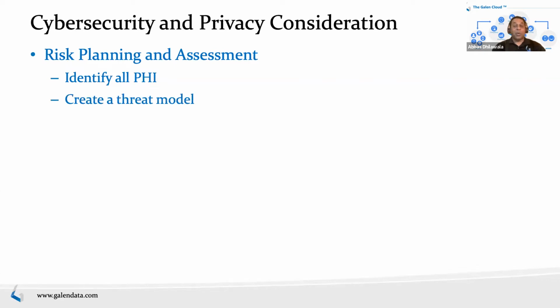Do threat modeling. What threat modeling does is essentially identify risk not only from a device perspective, but from the environment itself. So it's not what can go bad in the device, but what can go bad in the device if it is connected to, let's say, a user's home Wi-Fi, which may not be very secure, or if it's connected to a hospital network that has 20 other devices whose security may be questionable at best. So you have to consider the environment aspect of where it's deployed, how it's operated, who the users are, and how sophisticated they are.